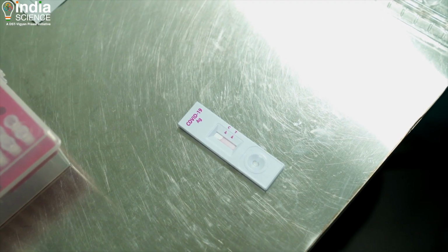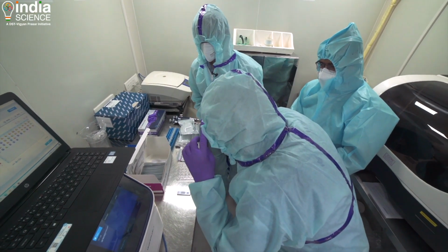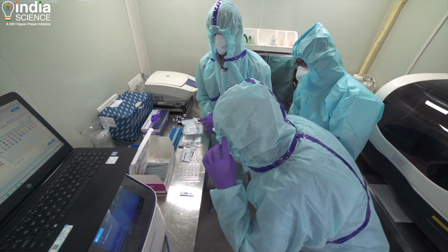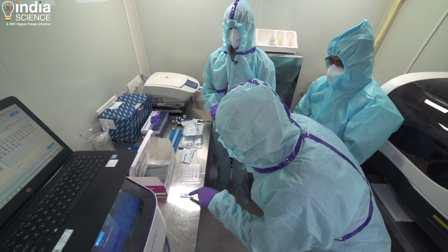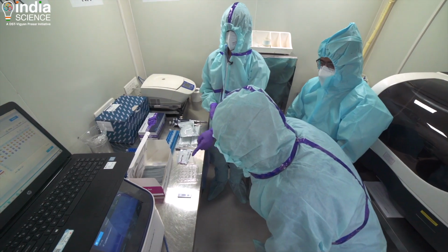Do you see a band there near C? I can hardly see anything thanks to the fogging. I can see a band, yes. There is a slightly darker colored band near C. It will become darker eventually in the next 5-10 minutes. And a band should appear also at T if you are positive, because that's the test sample. So this sample was negative.